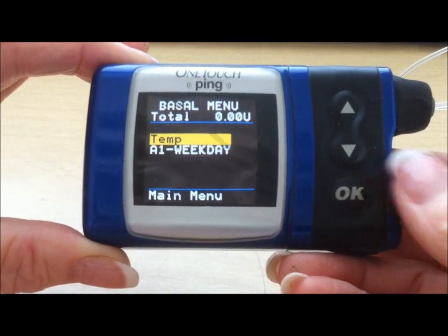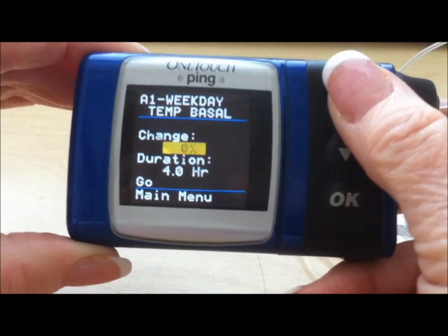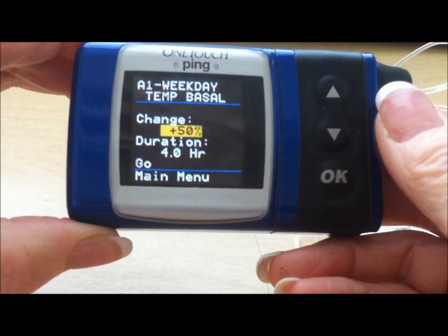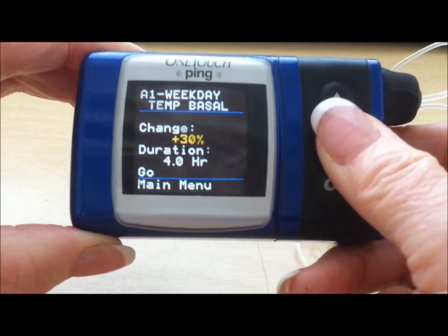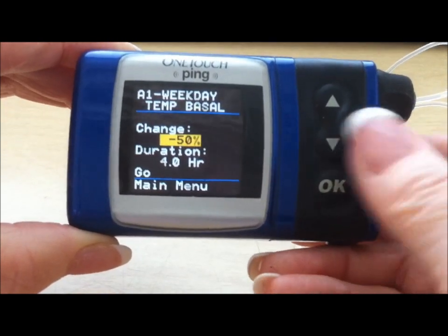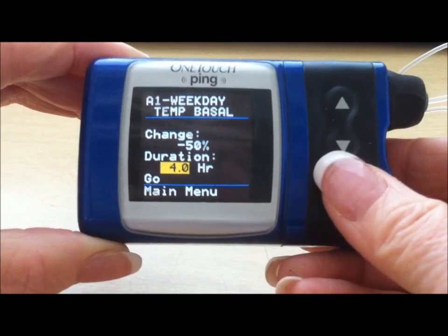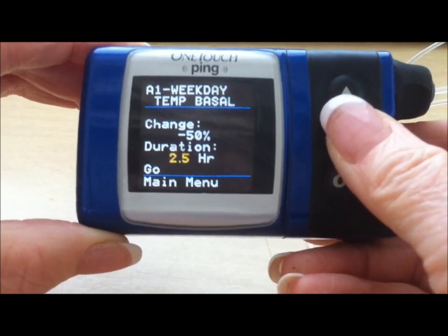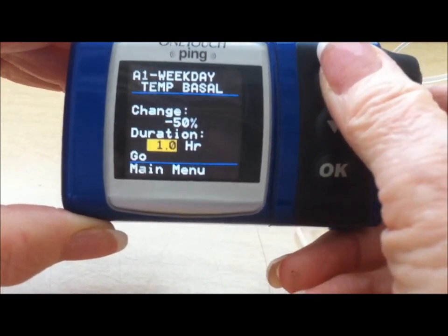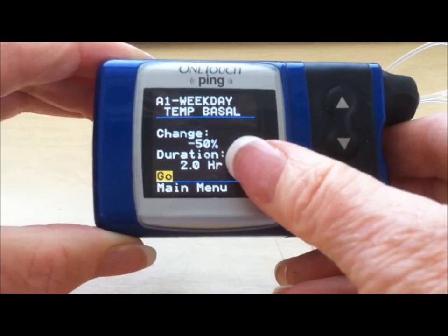A1 Weekday is the basal rate currently running, shown in capital letters. We want to override that with a temporary basal rate, so press temp. It drops you into change, blinking at 0%. If you need an increased basal rate, use your up arrow — it goes up in 10% increments: 10, 20, 30, 40, 50. If you need less insulin, use your down arrow, going down in 10% increments. In this example we'll use minus 50% for two hours. The default is four hours, but we don't want four hours — press Enter and go down. It goes down in half-hour increments; you can do this anywhere from half an hour to 12 hours. Go up to two hours. It stops at go, giving you a chance to review that you want a minus 50% basal rate for two hours. Press Enter.